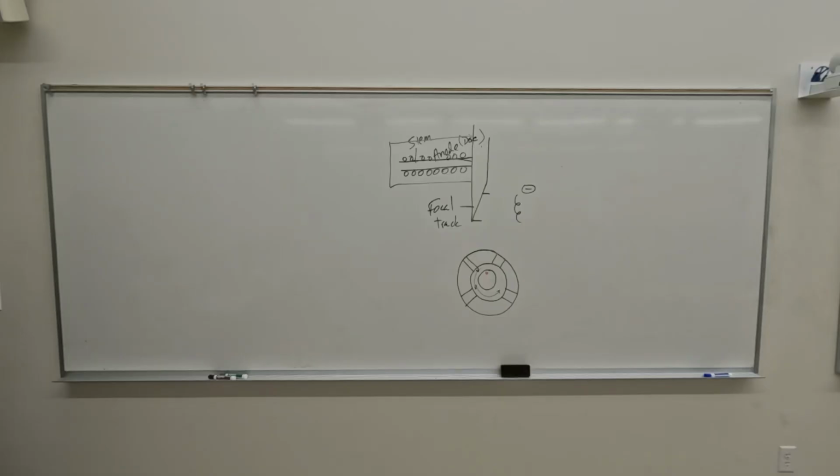So on page 117, it says that alloying the tungsten, usually with rhenium, gives it added mechanical support. Absolutely true. It's brittle. The rhenium gives it mechanical support to withstand the stresses of high-speed rotation, yes, but the effects of repetitive thermal expansion and contraction, that is false.